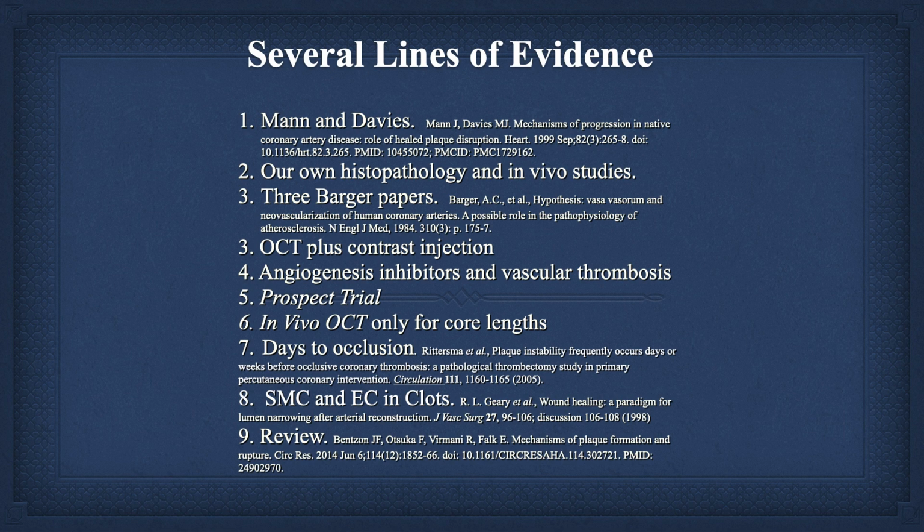long cores were associated with ACS. This is how we read it. Not that these studies were going after that hypothesis, and not that we knew that they were necrotic cores, but this long core concept we could see in tables in the in vivo studies.